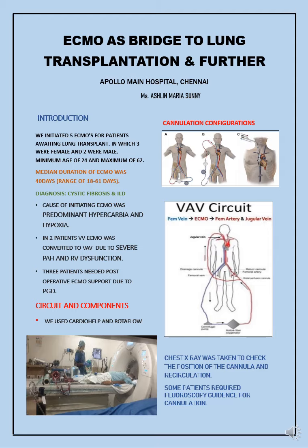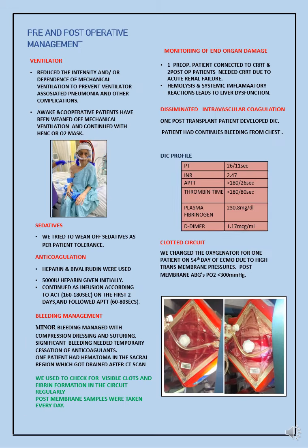Cannulation configurations are dual lumen cannula in IJV, left and right femoral vein cannulation, and femoral vein-IJV cannulation. For VAV ECMO, femoral vein, femoral artery and IJV cannulation were used. Reverse free flow cannula was used for distal perfusion.